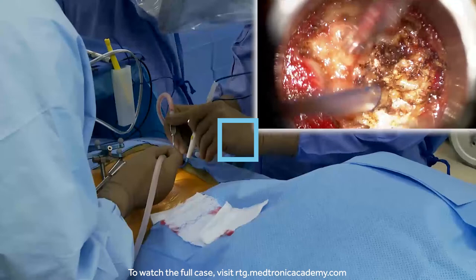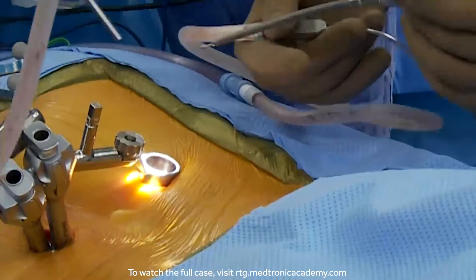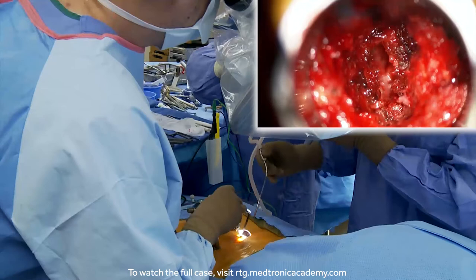Before I start drilling, one of the benefits of navigation is I can stick my probe down here and look and see where my pedicles are, because I don't want to drill into my pedicles. We use a bone dust collector to collect all of this bone so we can use it for our local autograft. So at some point, I do like to get some bone chunks. You can see what once was bone on bone, now there's actually a disc space there.